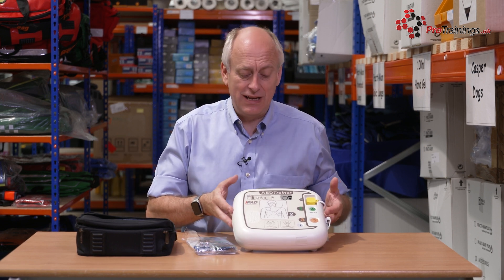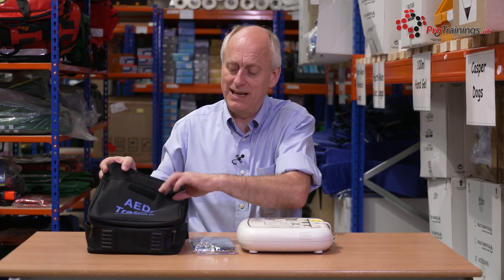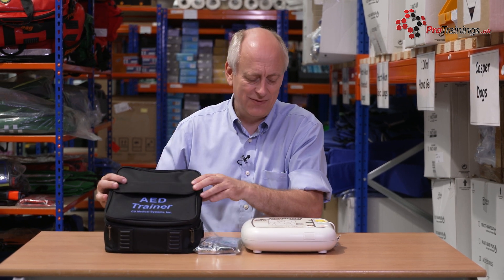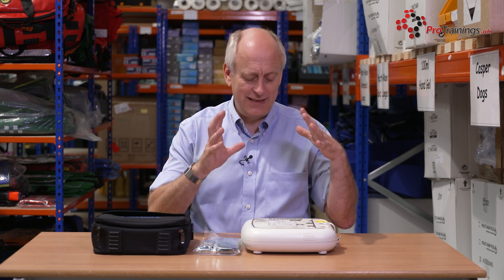Overall, it's a very good unit. With the carry case, all the bits and pieces — spares and remotes — go in the pocket on the front. It does come with a shoulder strap as well if you want to use that to make it easier. And it's very clearly identified as a trainer, because you would never want to get a trainer mixed up with a live unit. So this is the iPad AED trainer.